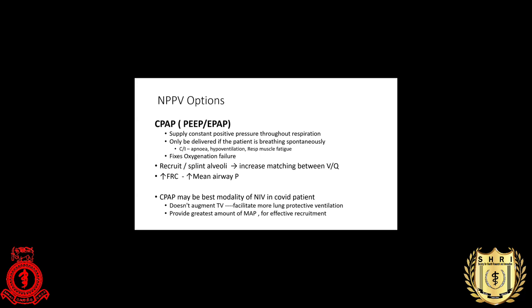Also, it will increase the mean airway pressure, by which you can increase the functional residual capacity of the patient, and that will cause a large amount of air at the alveolar level to the ventilator.